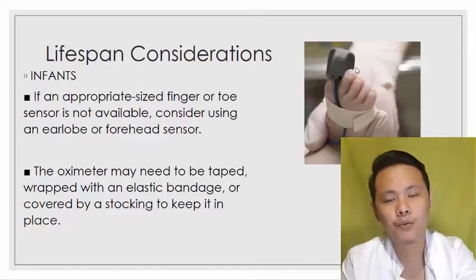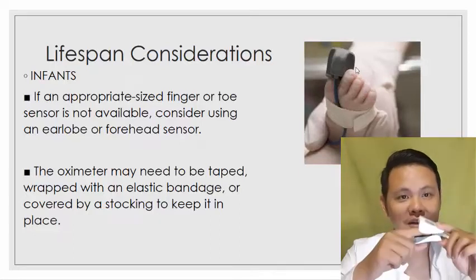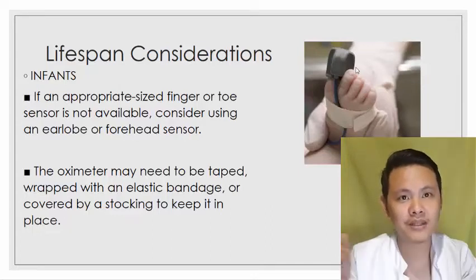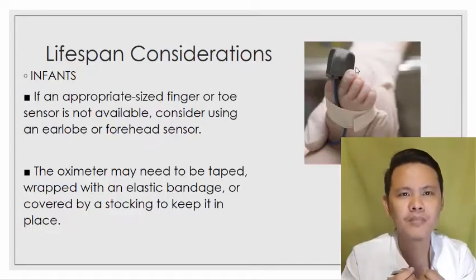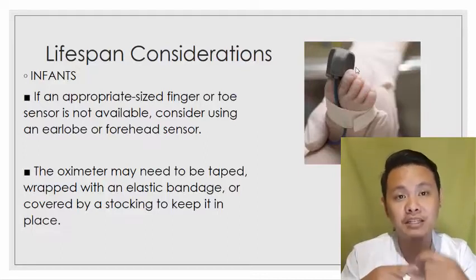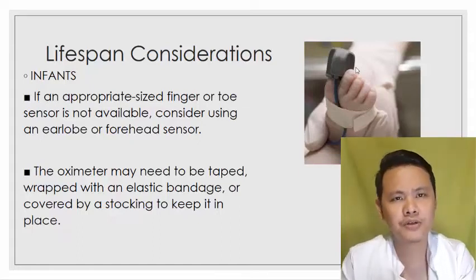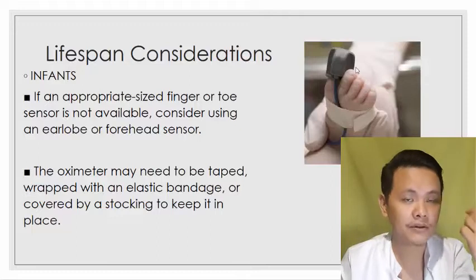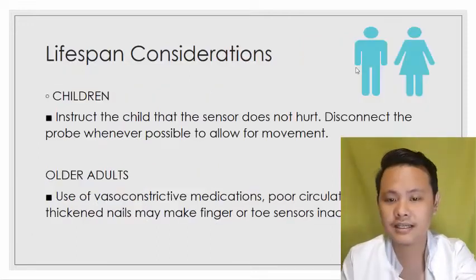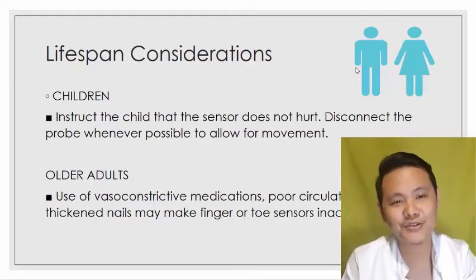Okay? Well, sometimes it depends din naman kung ano ang gagamitin natin. For example, ito ang gagamitin mo. Kaya madali po itong matanggal. So, if you're going to use naman the sensor, what do you call this one? The probe na wired, okay, i-attach mo lang naman yun sa may pasyente, pwede natin yun lagyan ng adhesive tape. Okay, especially yung mga sensor na nilalagay dito sa may forehead or kaya sa may bridge of the nose, okay, kailangan na ng adhesive.